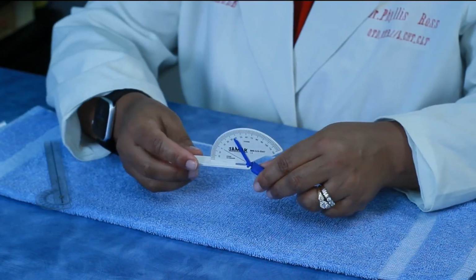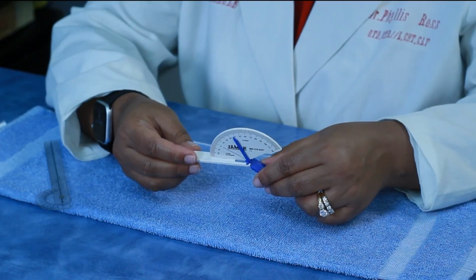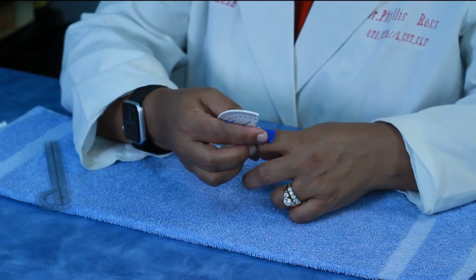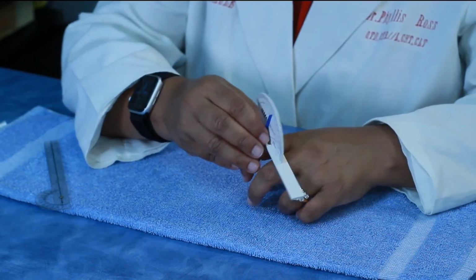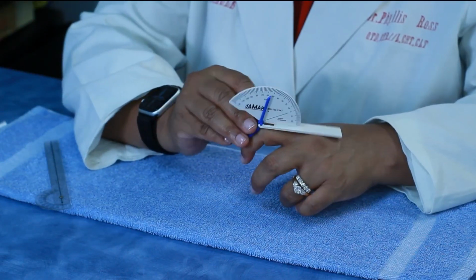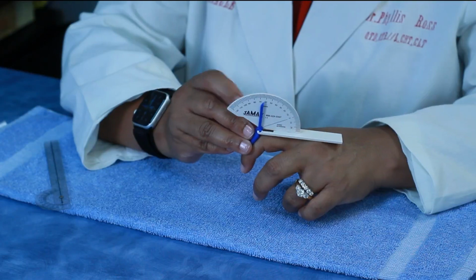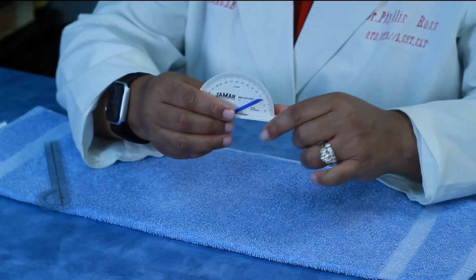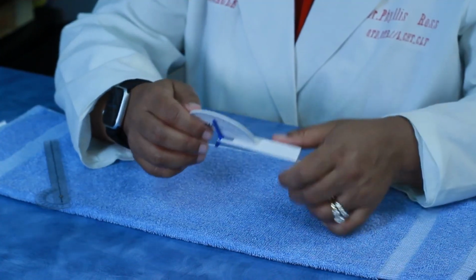And I don't really say, even though you have a movable and a stationary arm on this goniometer, it's technically designed as which arm is proximal to the body versus when the arm is distal to the body. So in most cases you can have a stationary and a movable, or a proximal and a distal. All right, so we're going to get measuring on our digits and our thumb.